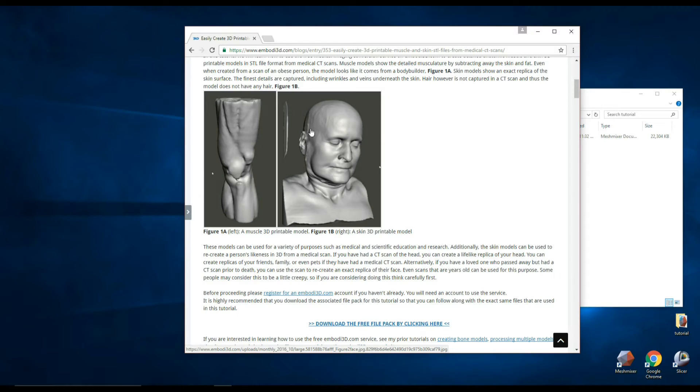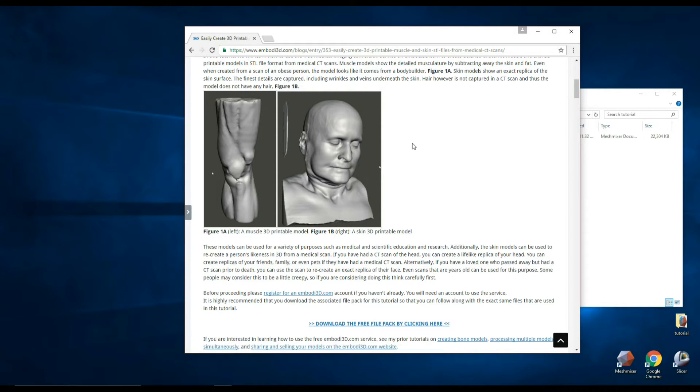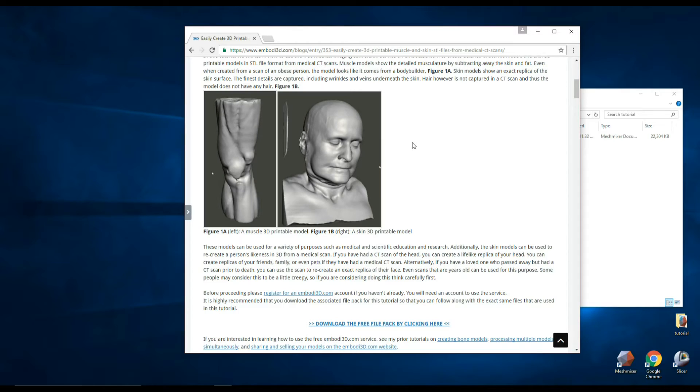So what we're going to do today is take this model, which is a figure of a head that was created from a medical CT scan of a real person, and we're going to turn that into a hollow structure using Mesh Mixer. This will make 3D printing a lot less expensive, consume a lot less material, and make the print come out faster.